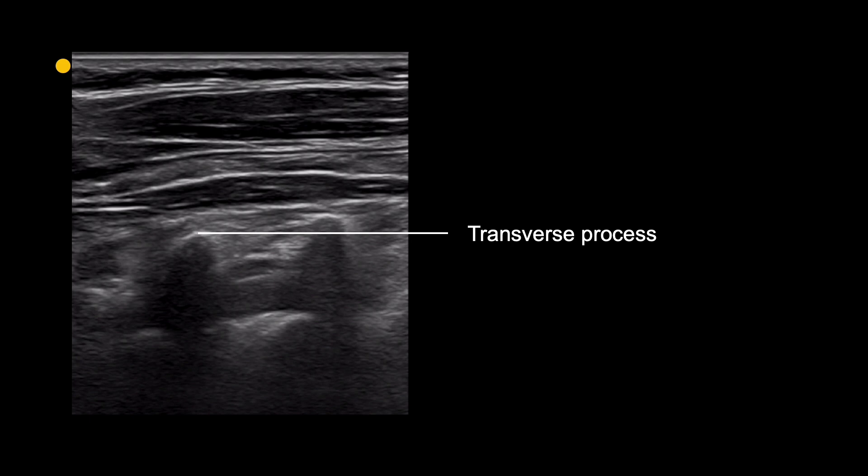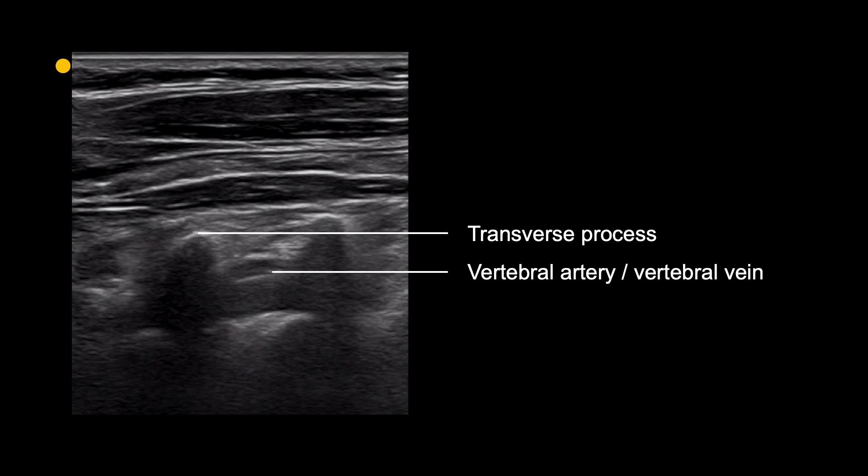In between each transverse process, a short segment of the vertebral artery and vertebral vein will be seen. The other segments of these vessels lies behind the bone of the transverse processes and cannot be visualised with ultrasound.